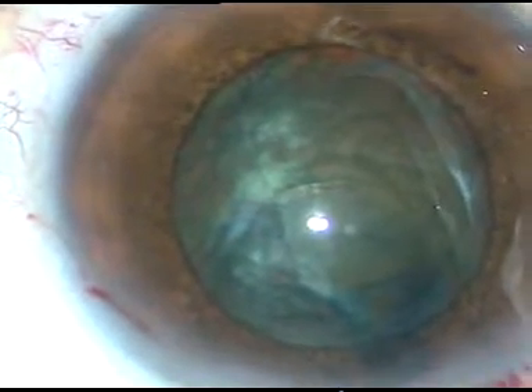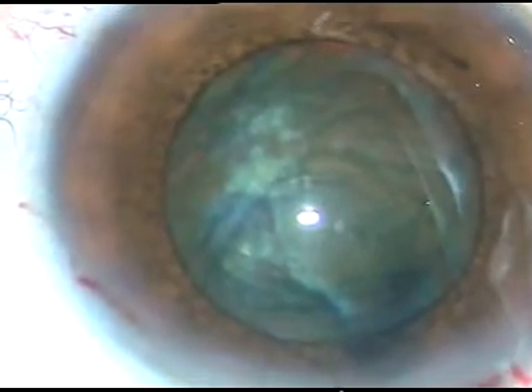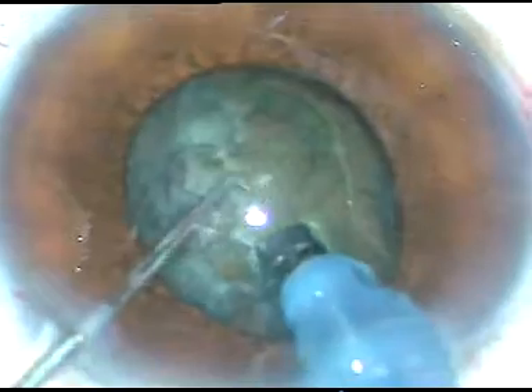I inject viscoelastic substance again and now is the time to enter into the anterior chamber with the tip of the phaco handpiece. The tip is introduced and now I start chopping the nucleus. At this time the pupil is very nicely dilated, say about 7 mm or even 7.5 mm. But as I start chopping, see — the pupil has become so small.